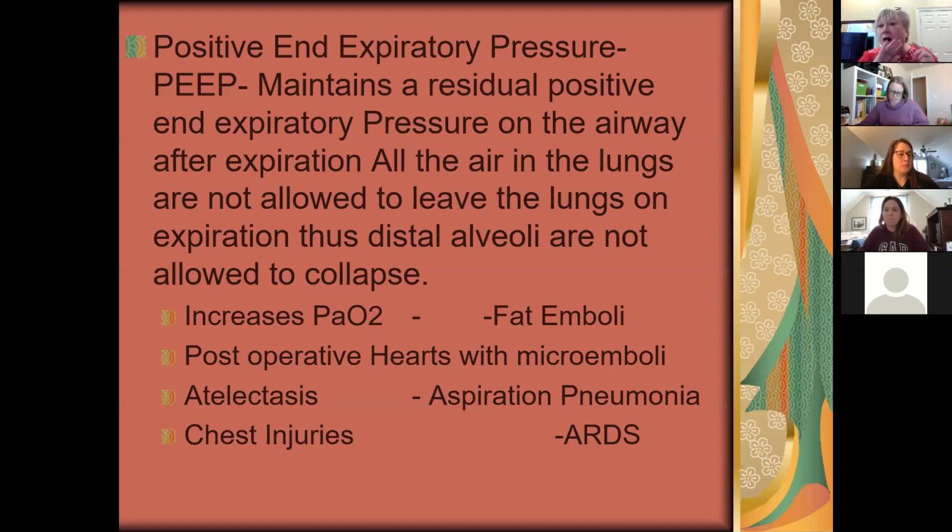Pressure support, they're doing all the work themselves, but we leave a little bit of positive pressure at all times in their airway so that they don't have to quite open the airways as hard by themselves. They're doing all their own breathing, just leaving a little bit of positive pressure in there. We're not giving them a breath. They're breathing on their own. Just a little bit of positive pressure.